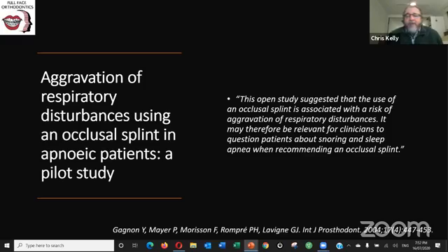I'm getting dentists sending me patients for mandibular advancement splints, and I'm not promoting myself. I'm just saying that people are making mandibular advancement splints for TMD patients, not just for sleep patients. They're doing it for what they would consider a primary TMD patient who has a secondary sleep apnea score, which might be quite insignificant, but they know that if they put a regular MOS, a maxillary occlusal splint, in their mouth, they're potentially going to make that score of airway events increase. So they don't want to do that.